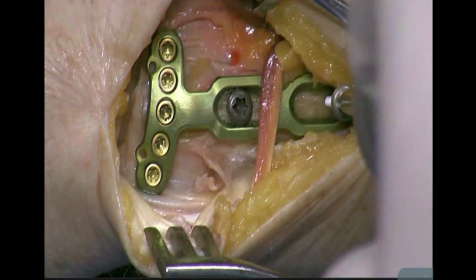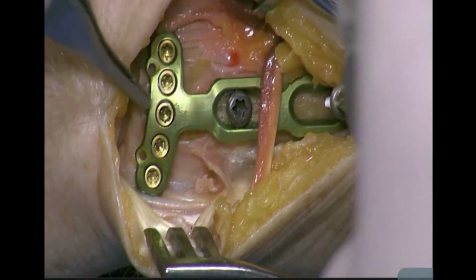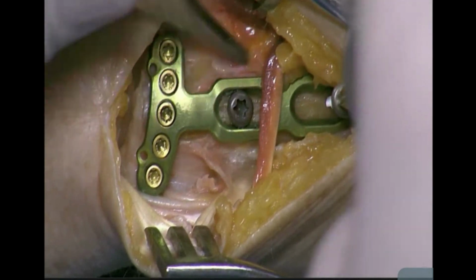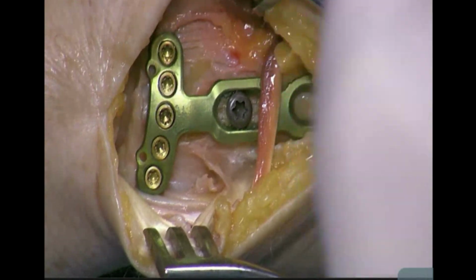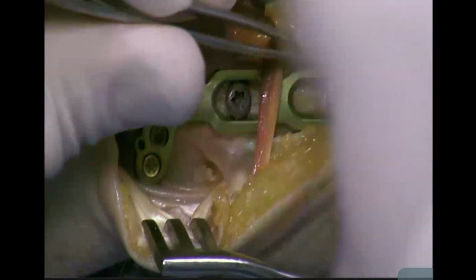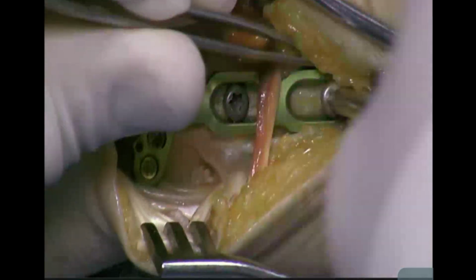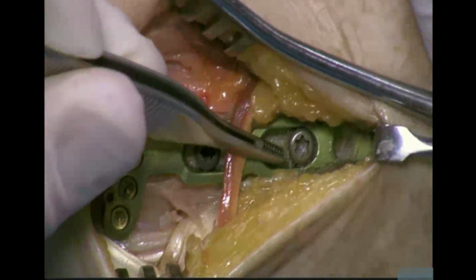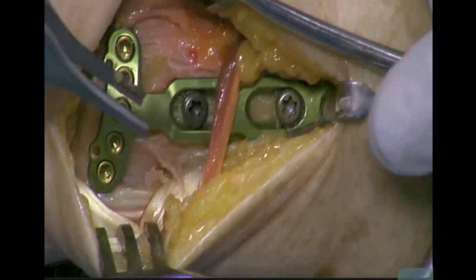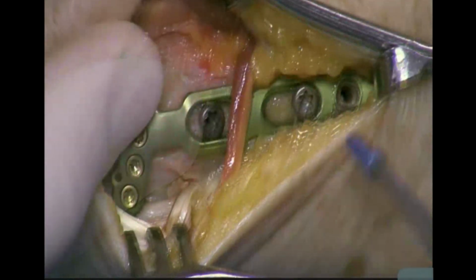So given two elongated holes, it gives us more flexibility to be able to choose the length where to put this distal portion. And very frequently, this whole area is too comminuted to allow sufficient purchase in that screw. So having the second elongated hole proximally gives us a lot of freedom in that regard. So now we'll do two locking screws proximally. Another 14.